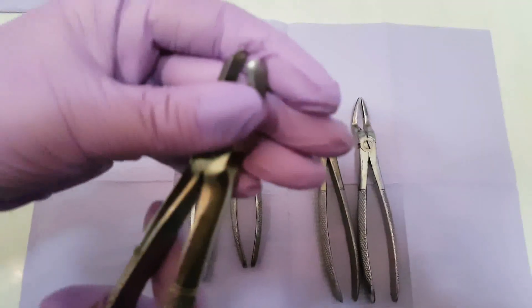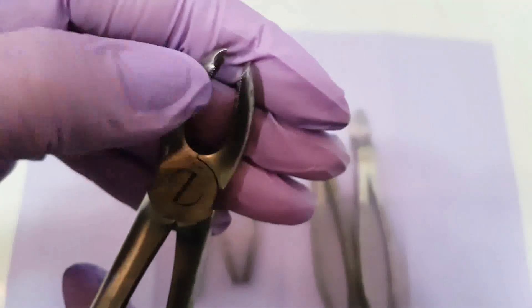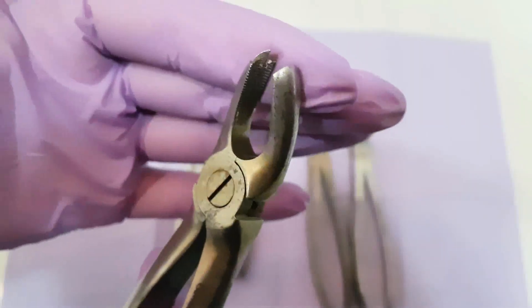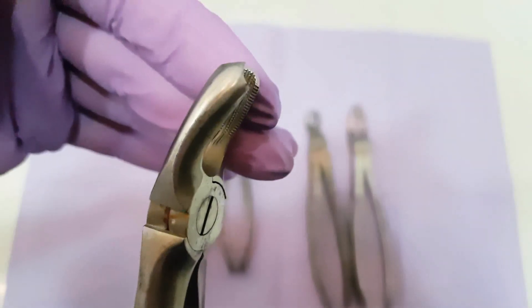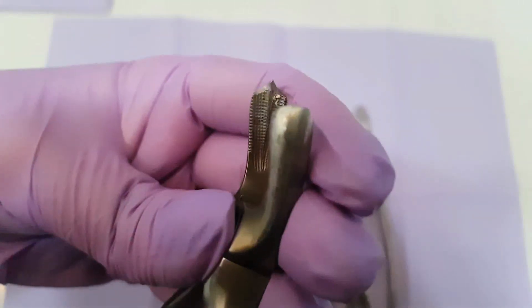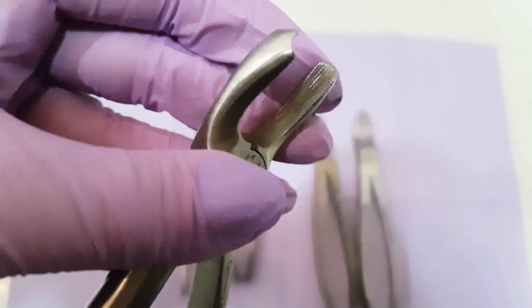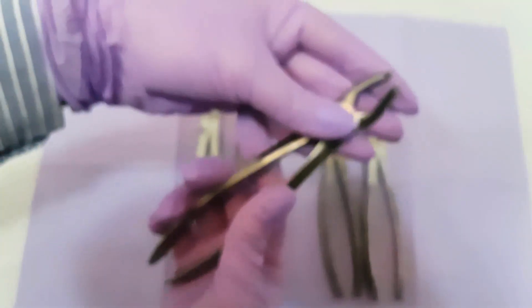This forcep is different from the others because on one of the working beaks we have a thorn that is used to put in the bifurcation. In another video we will show you how to properly put this forcep on the tooth. This is the forcep that is used to extract the first and second molar.